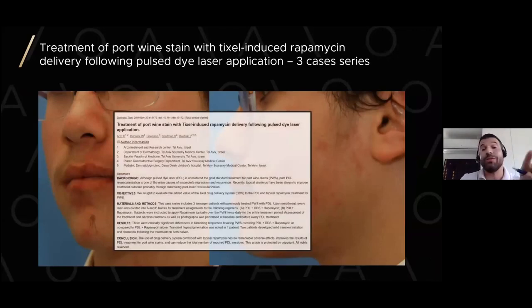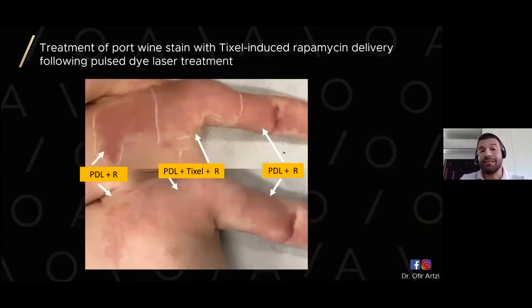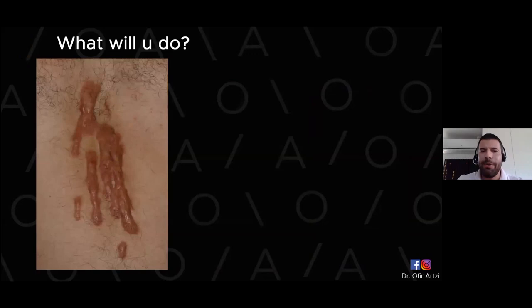And I have to say that we do have some other cases. Again, you can see the cases, this just middle area was treated with pulse dye laser, Tixel, and rapamycin. We have improvement, but the result, and I cannot really explain, they are not reproducible. So we do have patients and we do have children in which it had no effect on the improvement. So we didn't see more improvement with this combination of pulse dye laser, Tixel, and rapamycin. I will end up with scars and then we will allow questions.